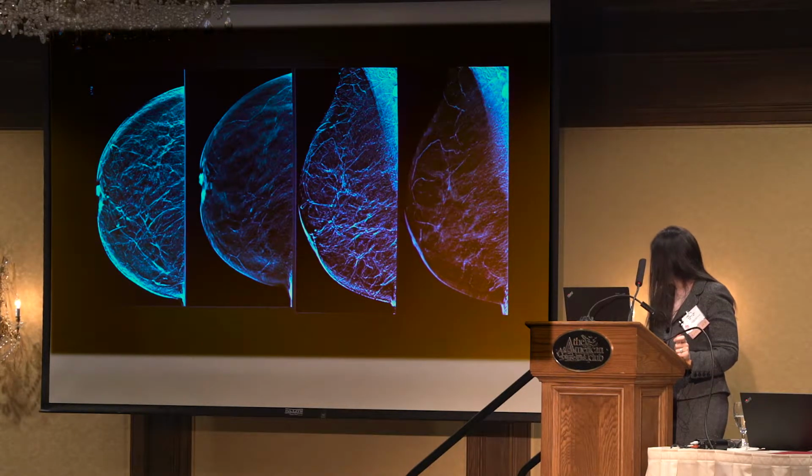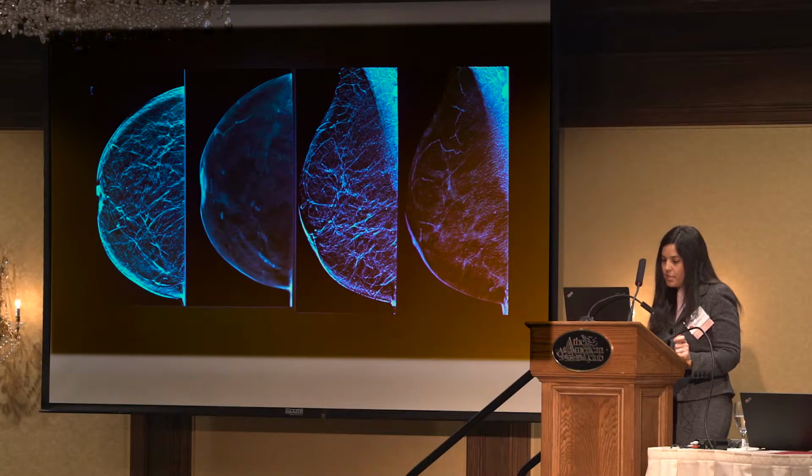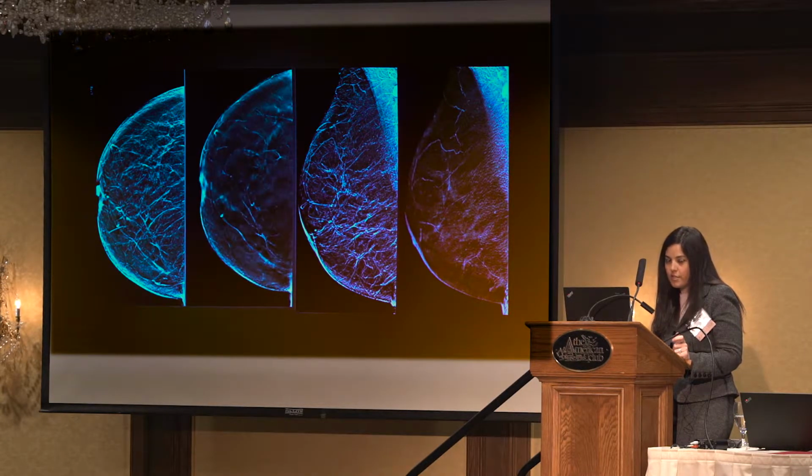On the MLO view, and I'll scroll the CC view just one more time. I don't know if you guys all had a chance to catch it.